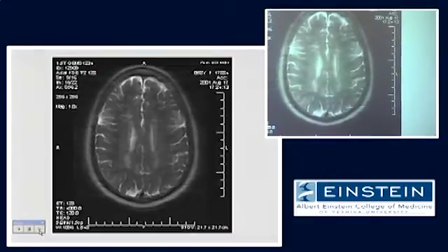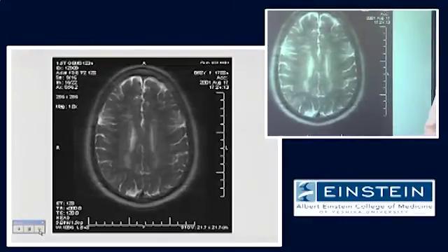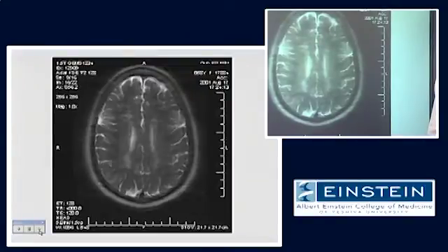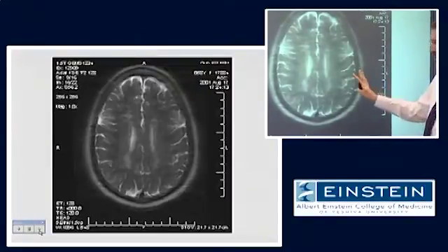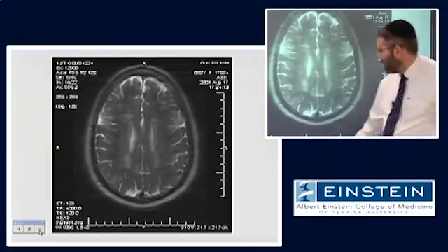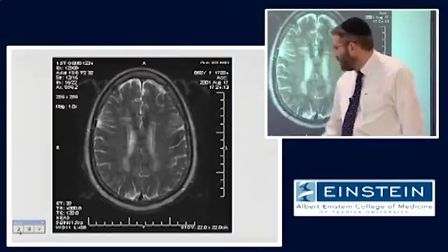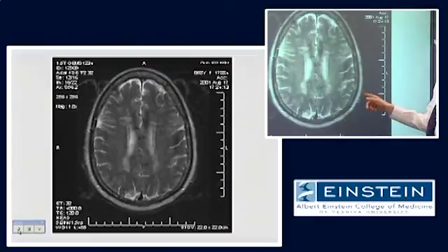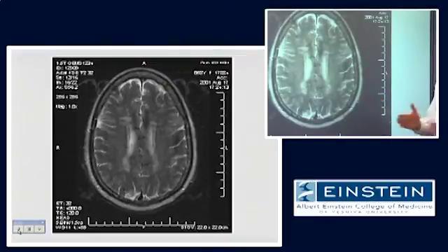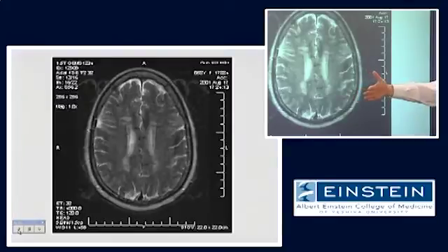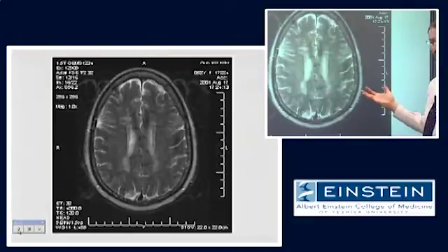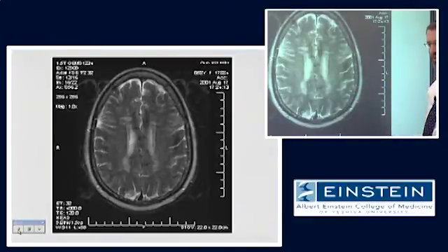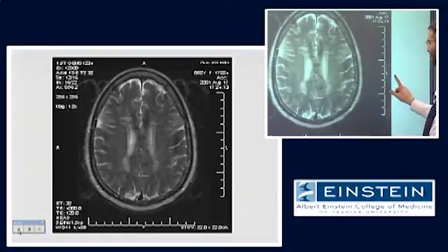What happens as you go to higher and higher echo trains? Notice how the image looks blurry — look at the edges of the fat in the scalp and see how much sharper those edges are at lower echo trains. With a longer and longer echo train, there's lower and lower signal amplitude at the latest echoes, so we don't have the power in the periphery of K-space to give us that kind of edge definition.